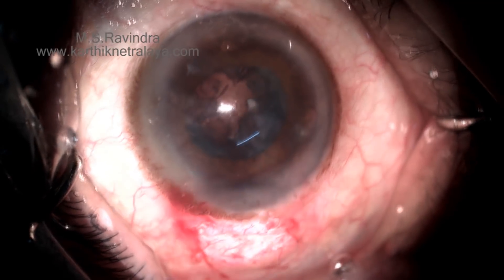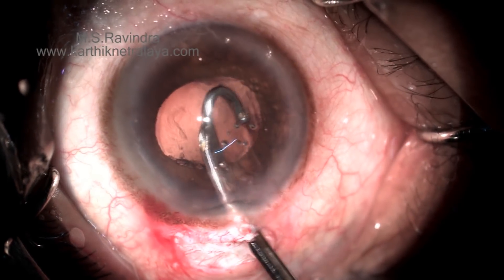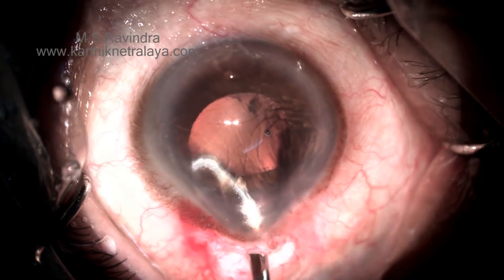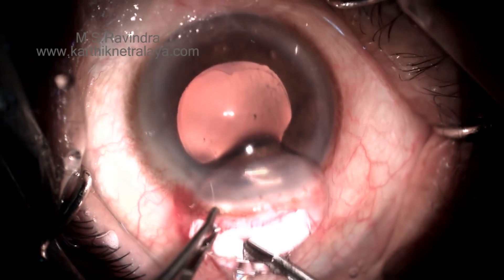The cortex is aspirated fully. It is extremely important to ensure that every bit of cortex is aspirated, as it does not come out like an immature cataract. You need to go to every clock hour in the fornices and look for chunks of cortex all around 360 degrees.